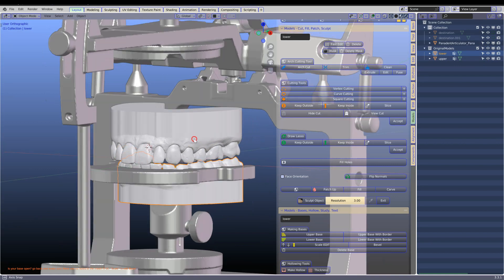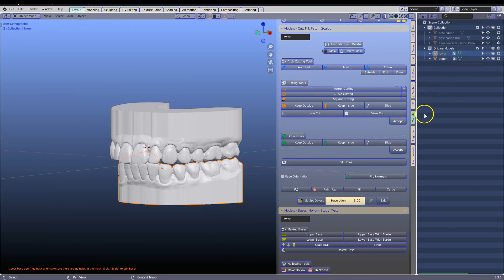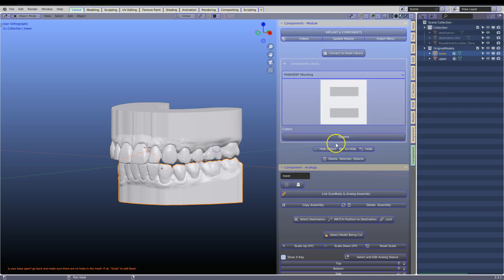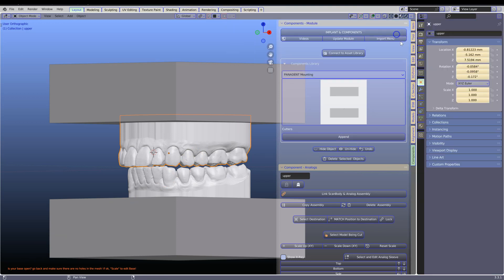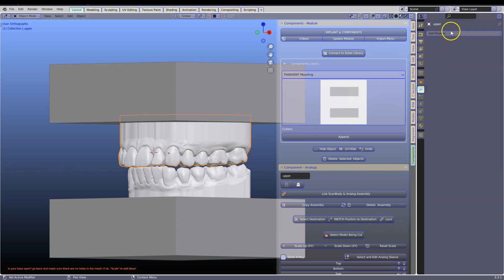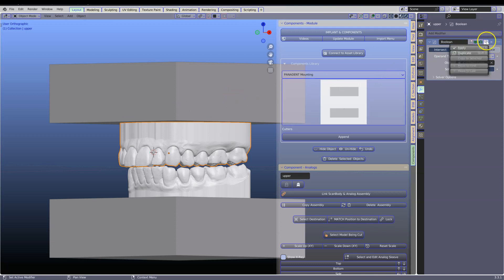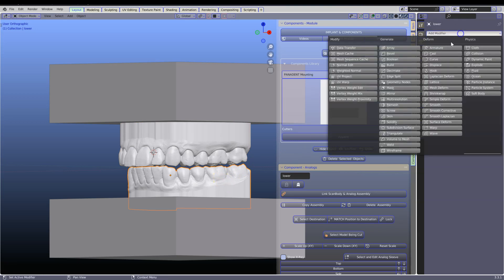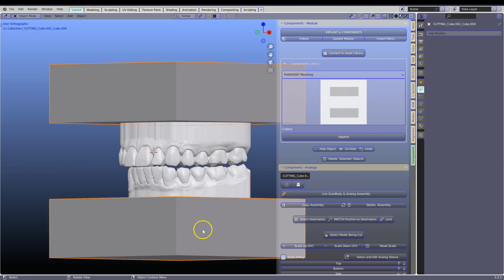Next we're going to need cutting tools to cut these models correctly. Go back to your components module and select the cutters — these are going to be used to cut the models. Open up the properties, and with the model selected, go to Add Modifier. Select the Boolean, click on Fast, take the dropper, and drop it onto your cube. Apply that, then do the same with the other side. Click on Fast, take the dropper, drop it, and you can see how it has been cut. Then exit and delete these.